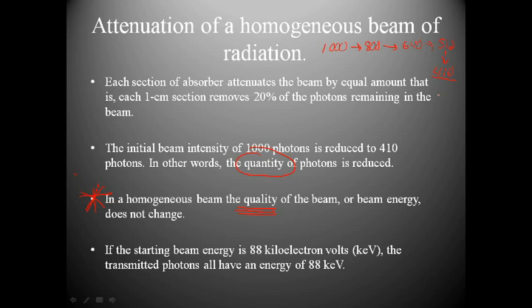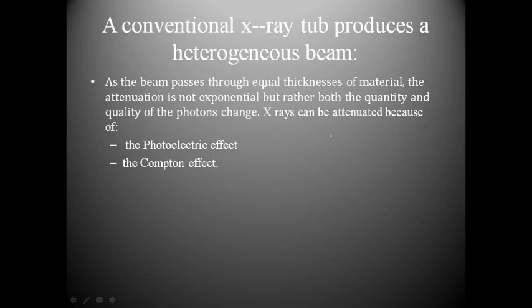If the starting beam energy is 88 keV, the transmitted photons all have the energy of 88 keV. The beam energy is not going to change, and they all have the same energy.